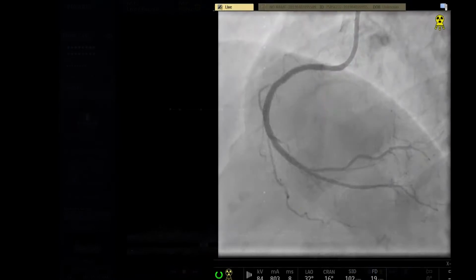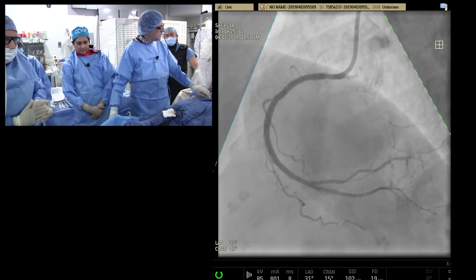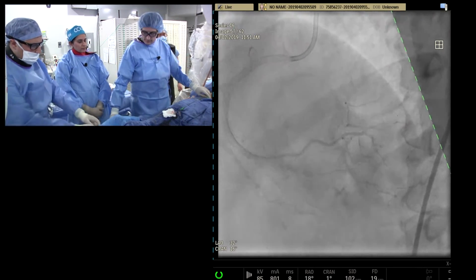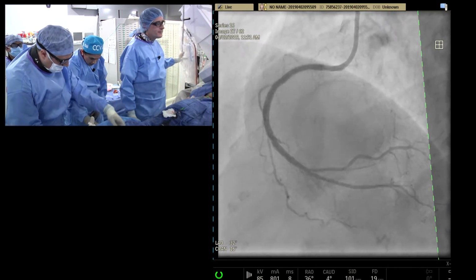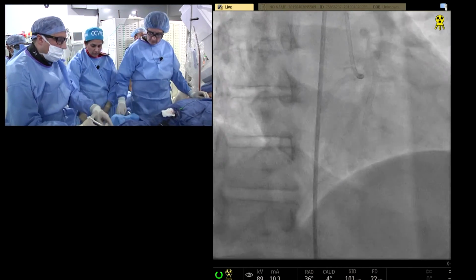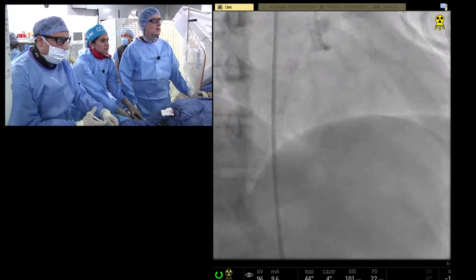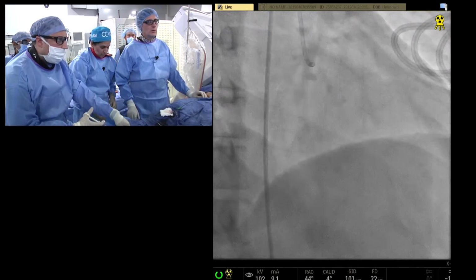I think this is a really good application of using IVUS. I think you shouldn't be using this in every case, but research from my colleague, Justino, has shown that in the more complex cases like this one, where there's a lot of stents implanted, very long, then there's some calcium there. That's the type of patient that will really benefit from optimized stent implantation.